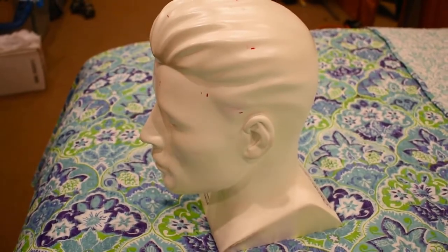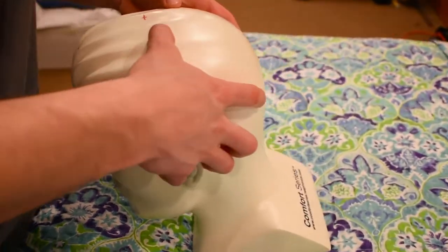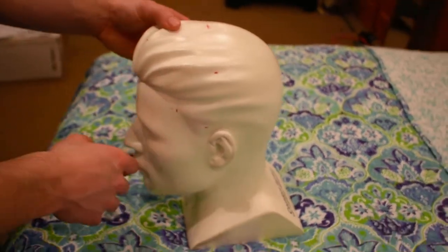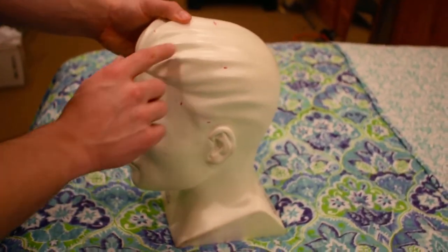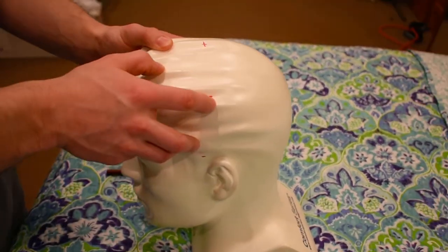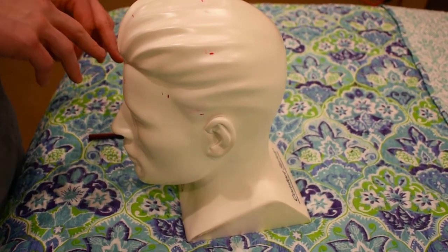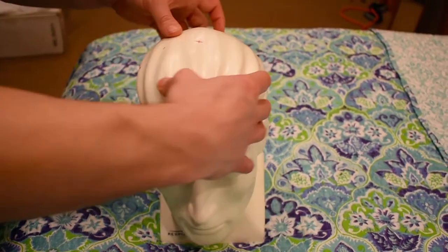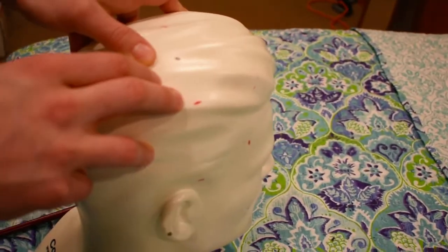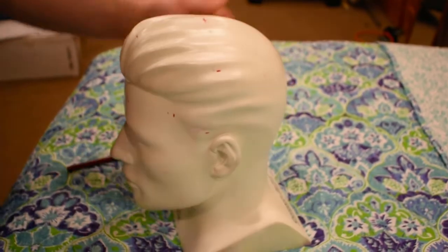Okay, so now we're going to complete our markings for C3, C4, and O1, O2 in the back of the head. What we're going to do is measure from FP1 all the way back to O1 through this marking that we made for C3. And then the same thing on the right side, we're going to measure from FP2 all the way back to O2 through this marking here for C4. So we're going to start with that on the left side.